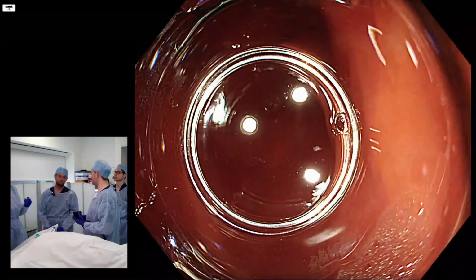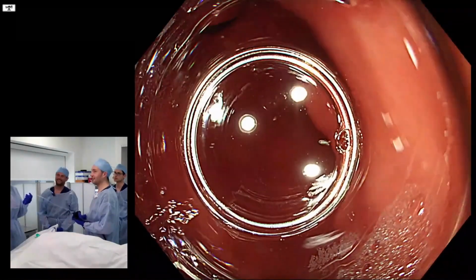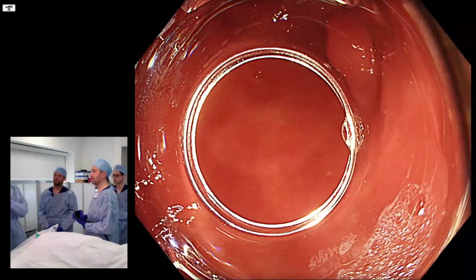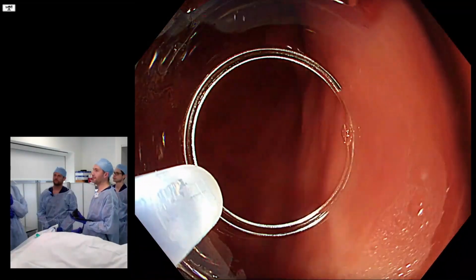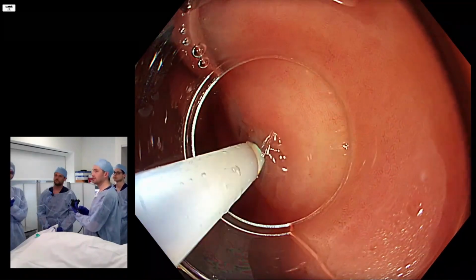Maybe it would be a nice thing if it was sitting right beautifully down here and I could easily tunnel down to it. Let's see what we can do here. Once you're in a tunnel, normally it's pretty easy to maneuver in it, but of course the major issue will be the position here. So let's see what we can do. Open, make a bleb away from it, inject.